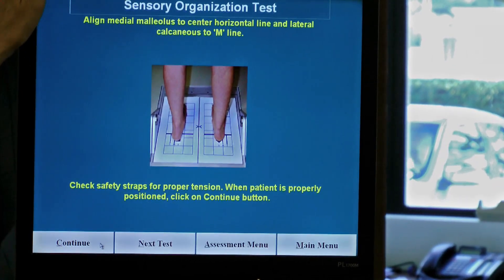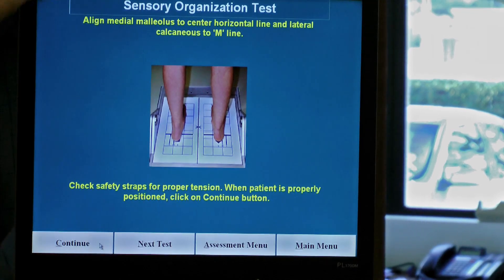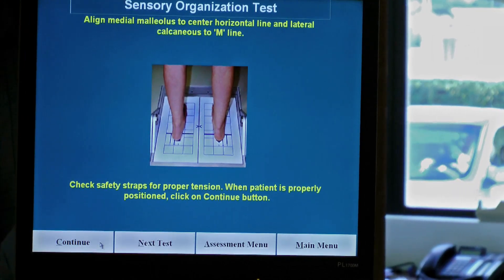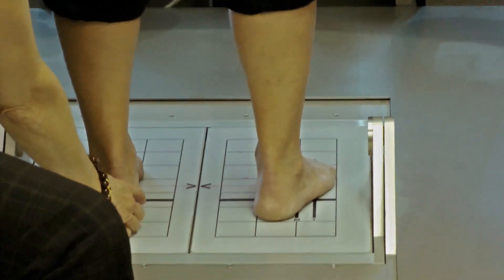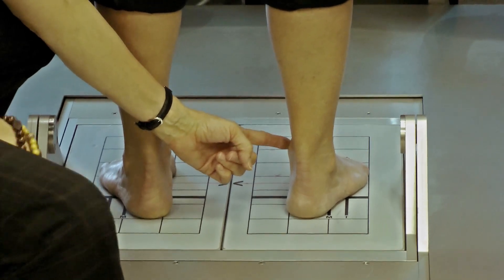The system is going to tell me exactly where I need to have my patient's feet positioned on the force plate. She needs to have her medial malleolus in the center, aligned with the center line, and the lateral part of the heel — the calcaneus bone — to the M line for her height, medium height. So I've got her so that her lateral part of her calcaneus is about at the M line, and the medial part of her heel is at that wide black line.